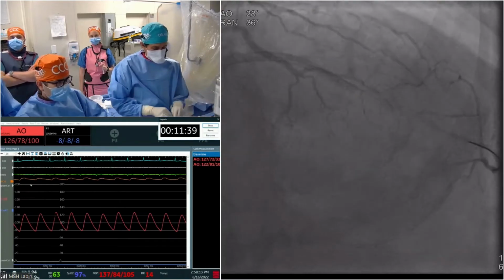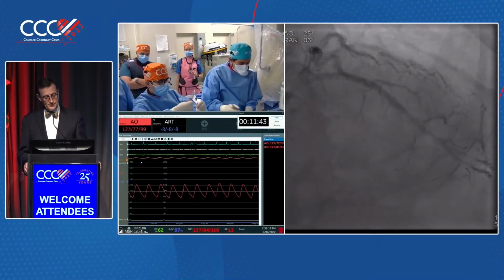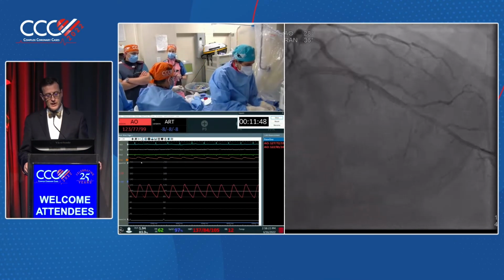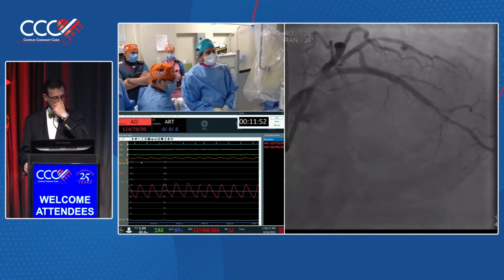All right, we don't have to stay here unless you want us to stay. We'll go back to Dr. Sharma. No, I think you can go back, finish that case, because I'm about to start the second CTO in room 2. So very good here, we will recross, kiss, we give vasodilators, and otherwise LED is done.